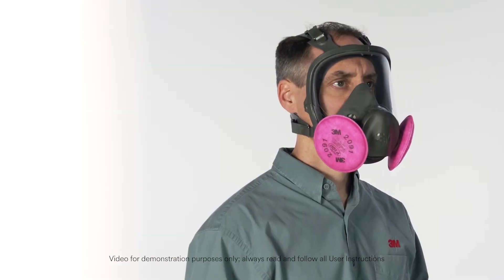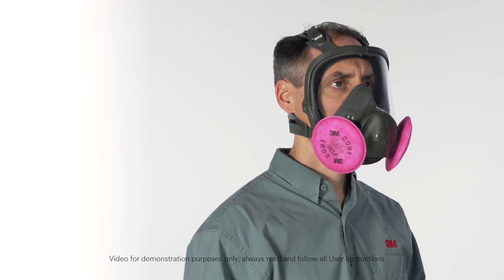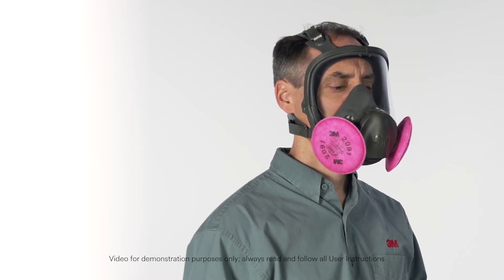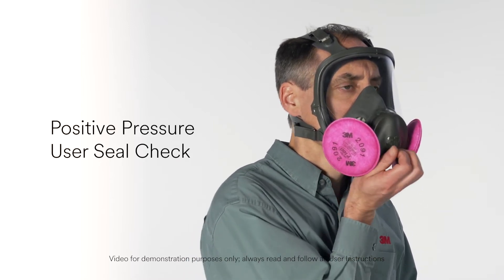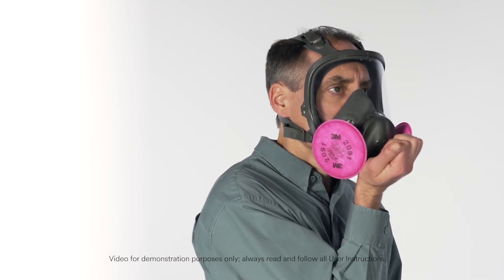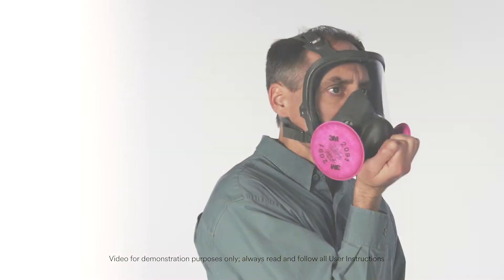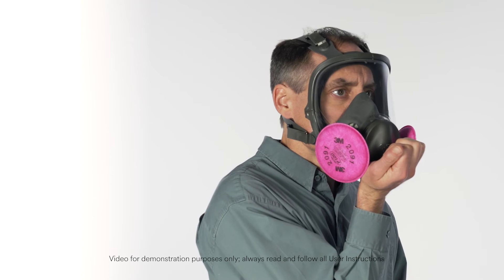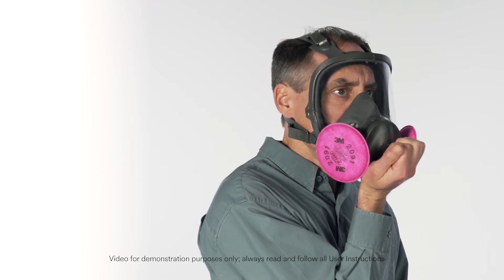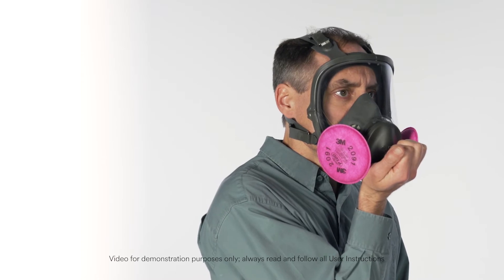Always check the seal of the respirator to your face before you enter any contaminated area. You must perform either a positive or negative pressure user seal check. To perform a positive pressure user seal check, place the palm of your hand gently over the bottom of the exhalation valve cover, being careful not to apply too much pressure and disturb the face seal. Exhale gently. If the facepiece bulges slightly and you feel no air leaking between your face and the face seal, your respirator has sealed properly to your face.